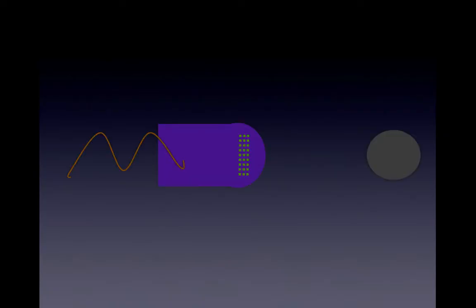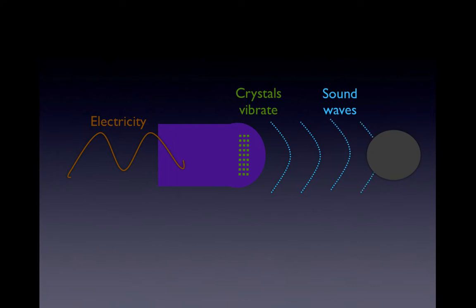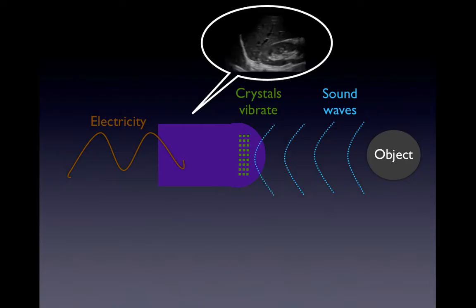This diagram shows the basics of ultrasound and machine functioning. Something called the piezoelectric effect. Piezo stands for pressure, electric is electricity. Electricity activates the crystal on the head of a probe. These crystals vibrate and send sonographic waves through a liquid medium to an object of interest. Sonographic waves reflect back, and the ultrasound machine listens for these waves and translates them onto a screen.